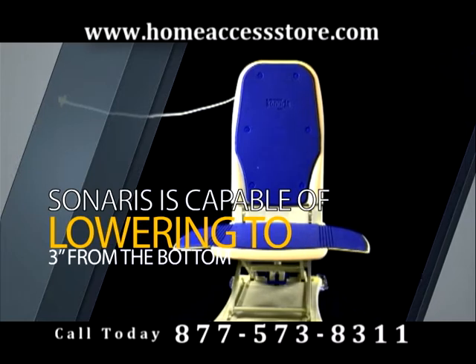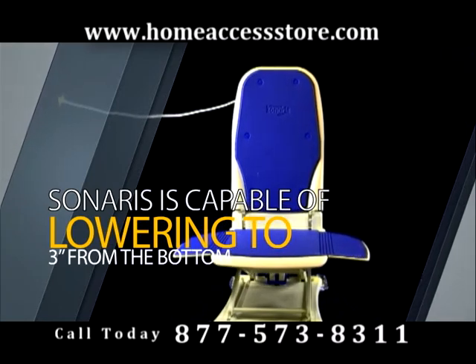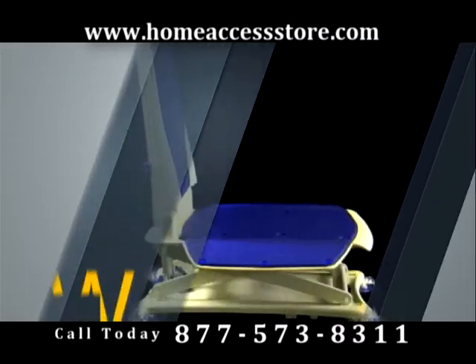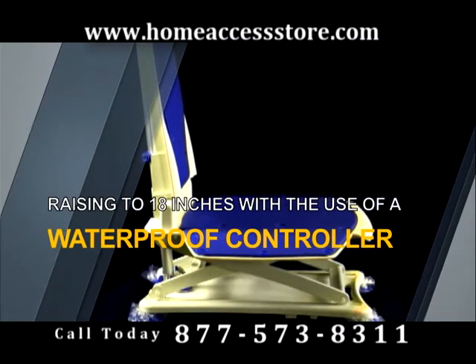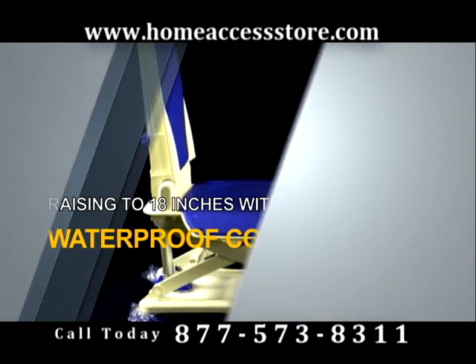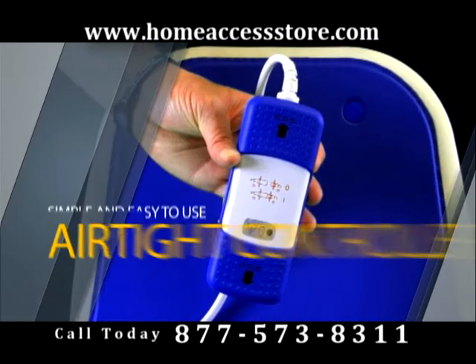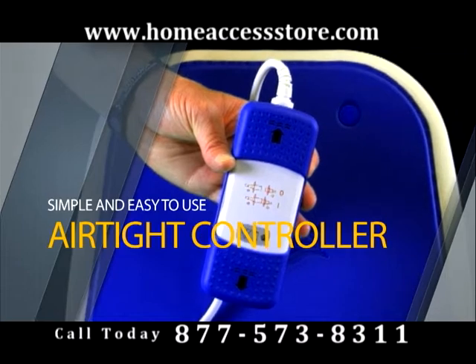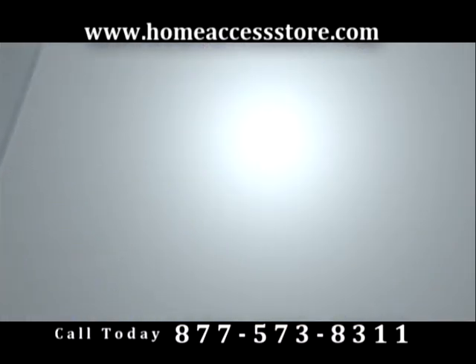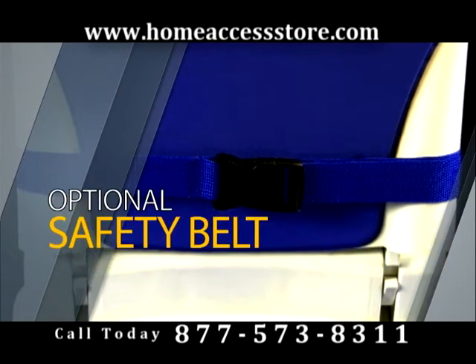Safe and durable, the Sonaris is capable of lowering to 3 inches from the bottom and raising to 18 inches with the use of a waterproof controller. Ideal for users and caretakers alike. Simple and easy to use, the airtight controller will power your Sonaris Bath Lift with the added security of ensuring there is enough charge to complete the full bath lift experience.